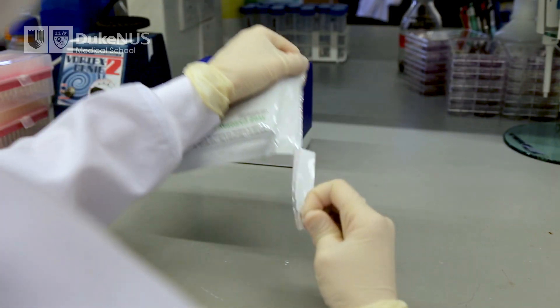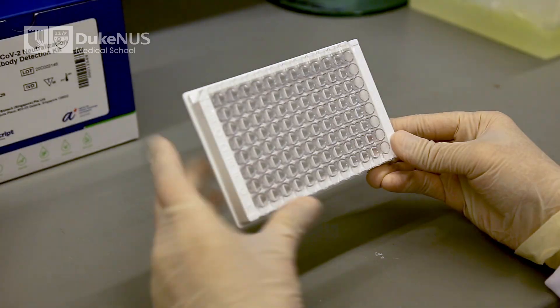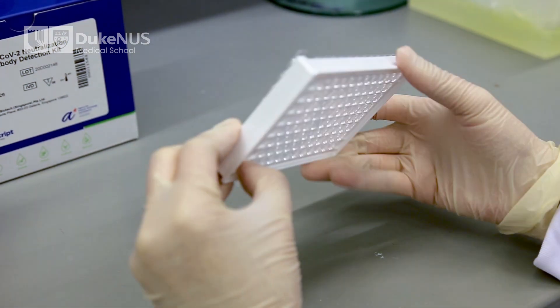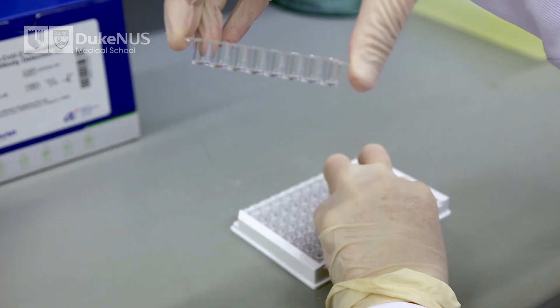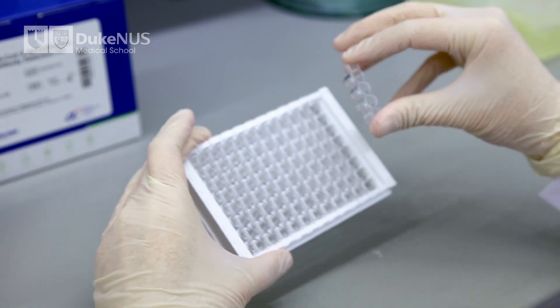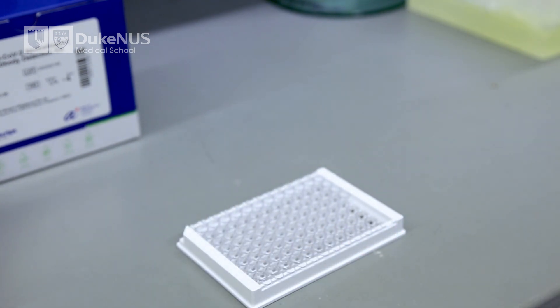While waiting, you can prepare the capture plate for use. Wells from the capture plate can be dismantled as shown. Carefully press the back of the well — the column of wells will snap out of the capture plate. You can also remove part of the column by twisting along its axis. This is useful if you do not wish to use all 96 wells for one experiment. Place the detached wells back into the foil pouch for later use.